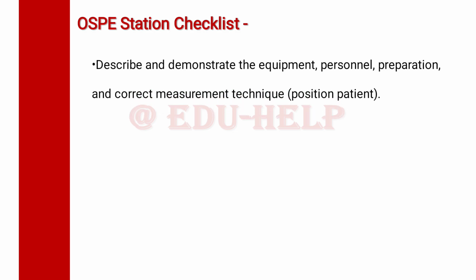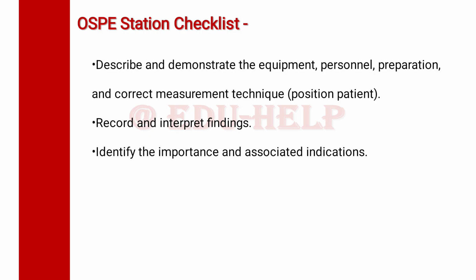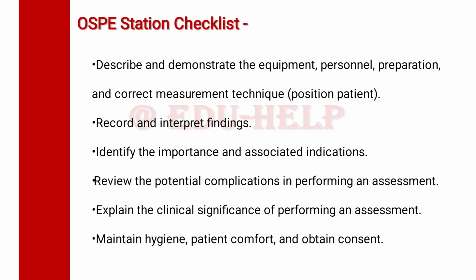Finally, the OSPE station checklist. The examiner should check whether the student has described and demonstrated the equipment, the person, the preparation, and correct measurement technique, like positioning of the patient, whether he or she has recorded and interpreted the findings accurately, whether he has identified the importance and associated indications or implications, whether the student has reviewed the potential complications in performing any kind of assessment, whether the student has explained the clinical significance of performing an assessment, and whether the student has maintained hygiene, patient's comfort, and obtained consent from the patient.